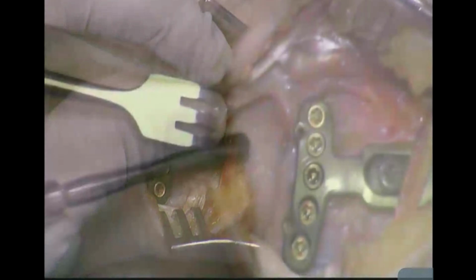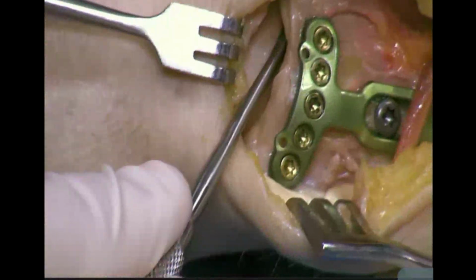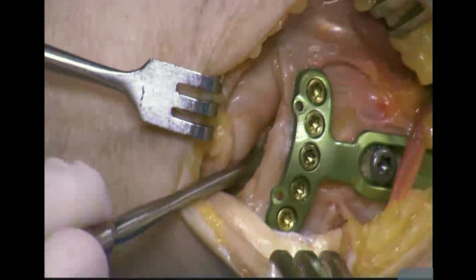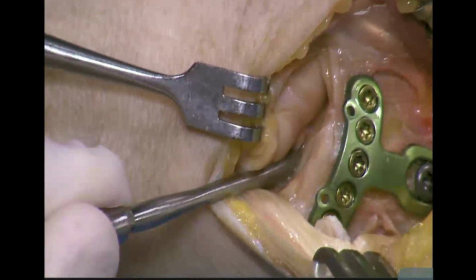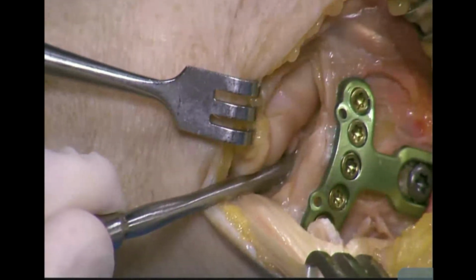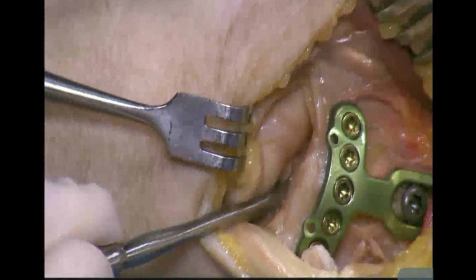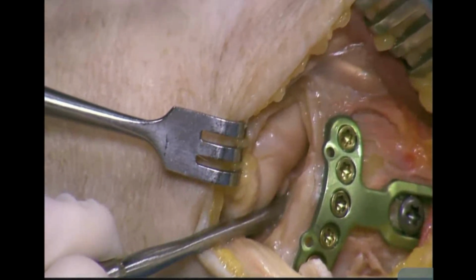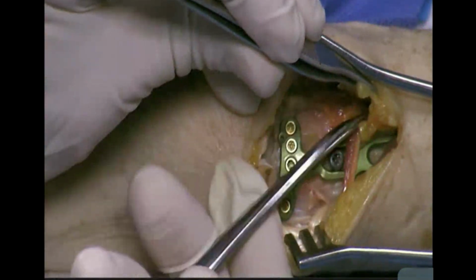All right. So after our fixation, I'm going to directly inspect this joint. And here I've got no screw penetration. I know I've got a good reduction. I can see it both directly, and then we'll confirm this on C-arm as well. But I know that inspecting it directly is more accurate. Now that we're happy, we're going to go to closure.